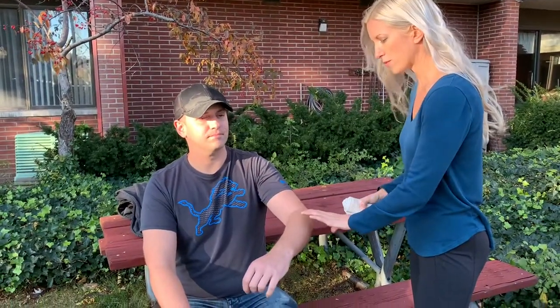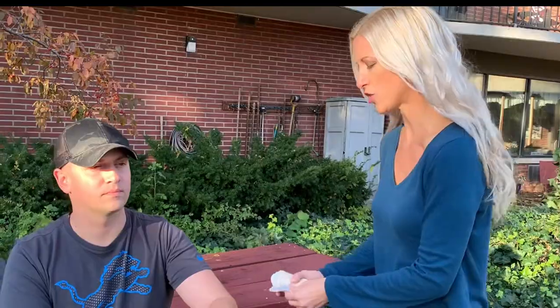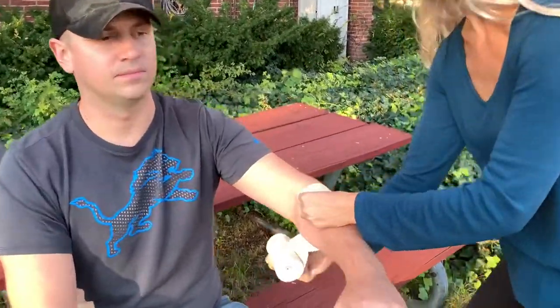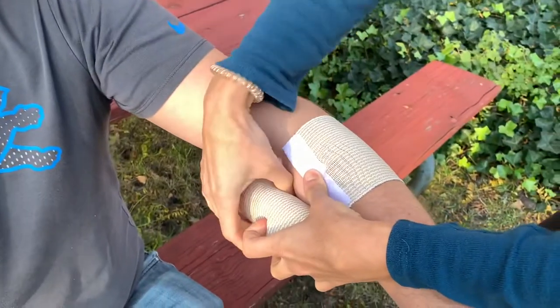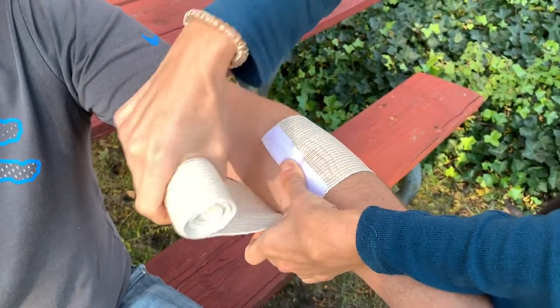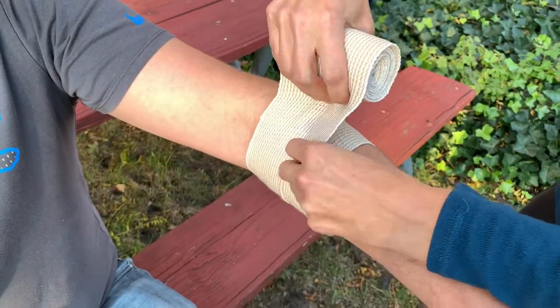So you always want to start wrapping from below the elbow in the forearm, especially if there is swelling in the elbow — that will help move the fluid back up towards the heart and into circulation. So you're going to start below the elbow, wrap once around. This one has velcro so you can secure it, but if your elastic bandage doesn't have velcro, you can wrap it twice around to anchor it in place.